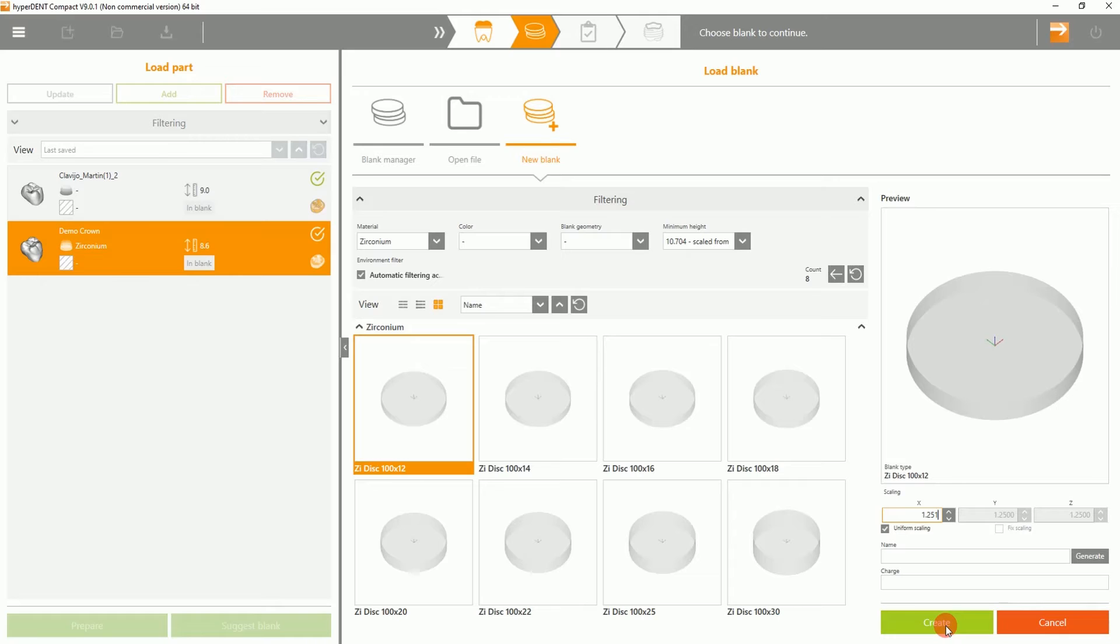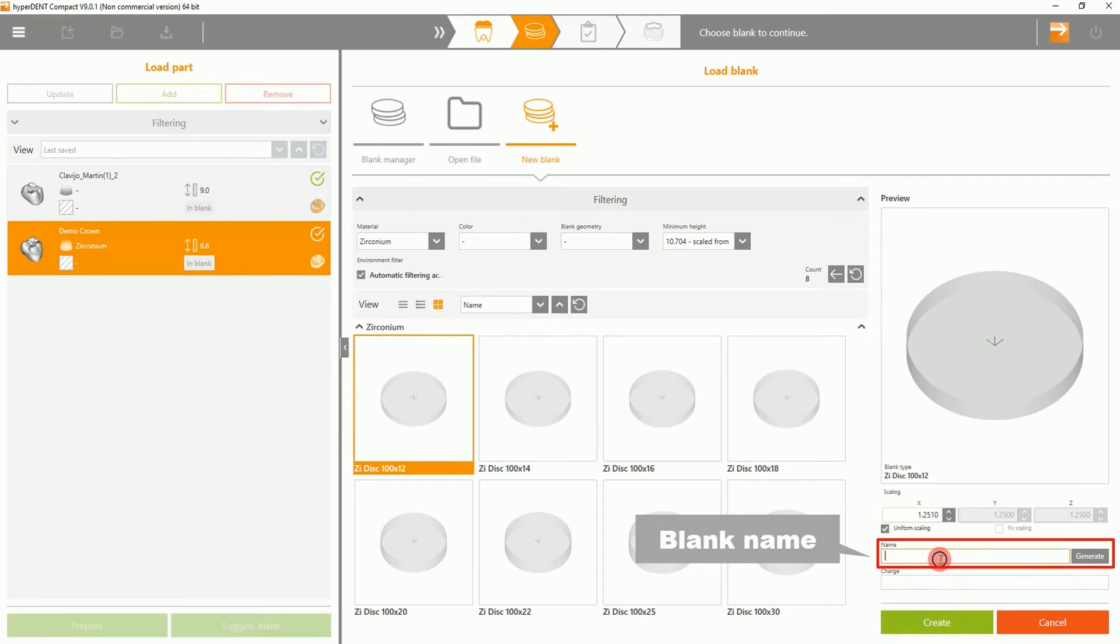Underneath, you can change the blank name. In this case, we will be naming the blank Zirconia 12mm. Then select Create.